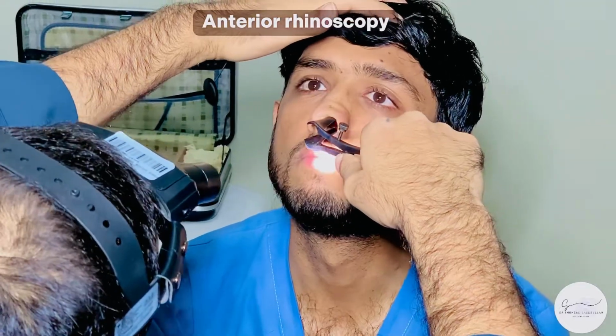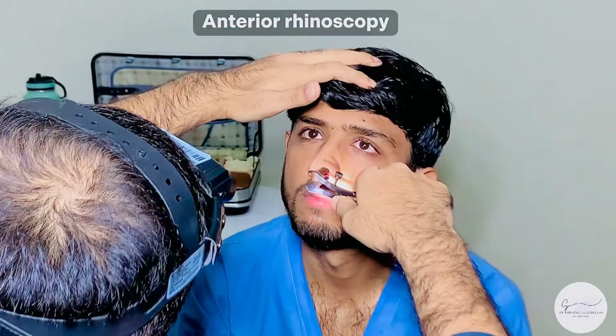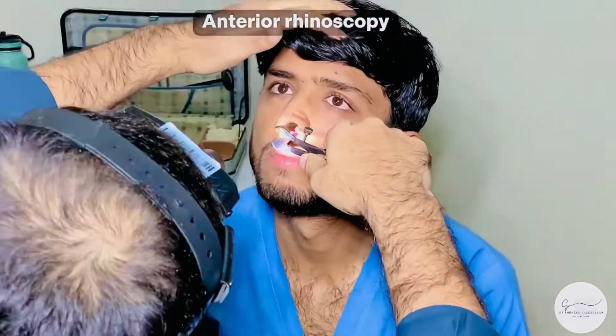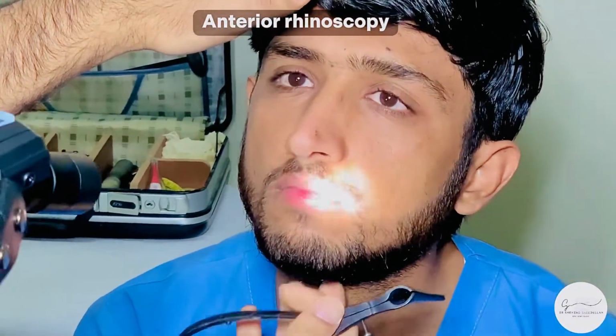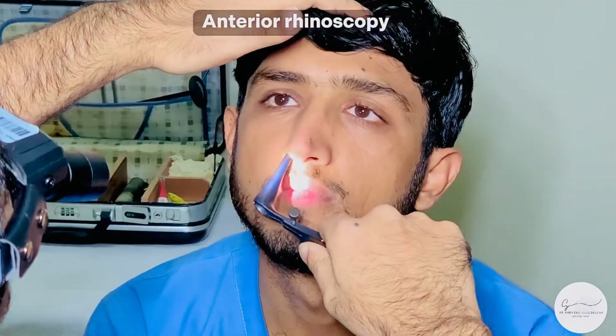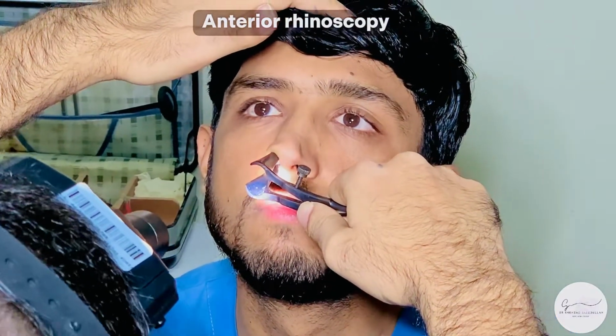So you will look at the roof. For that, you have to look up. You need to look at the floor. For that, you need to tilt the head down. You need to look at the medial wall, the septum, and the lateral wall. Then again, you repeat the step on the other nostril, gently introduce it, open it up, and have a look.